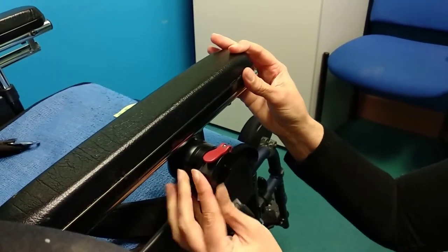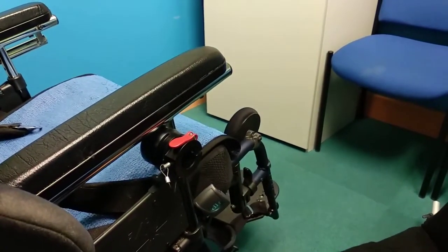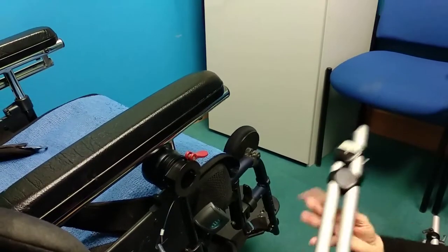Pop the pin back in so you can continue use of the chair like that. When you're putting the mount back on, take the pin out and adjust the lever, because that loosens things and allows you to then line everything up.